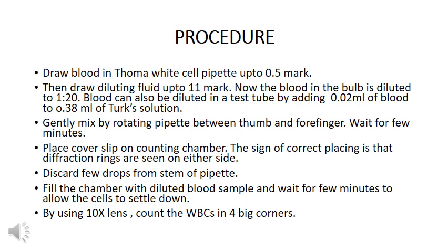So we will gently mix the blood with the fluid. Then we will wait a few minutes to lyse the RBCs.